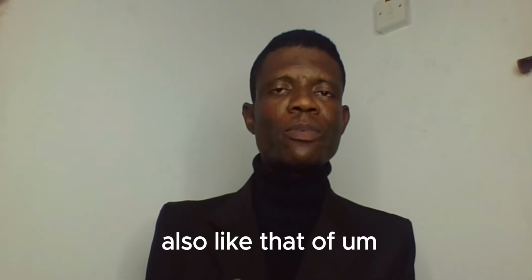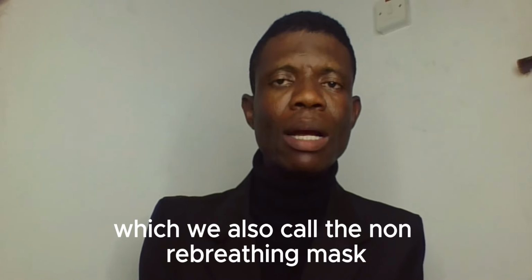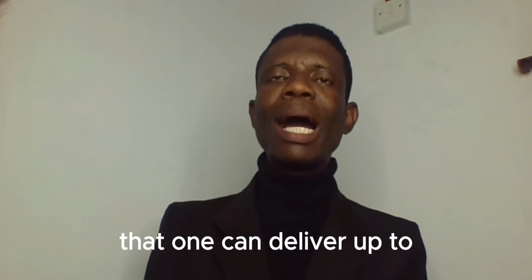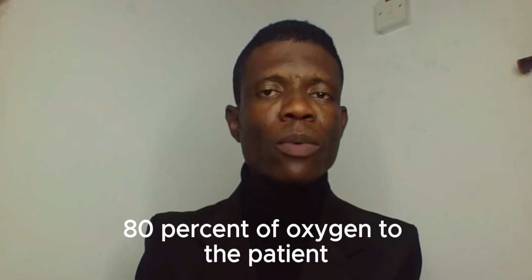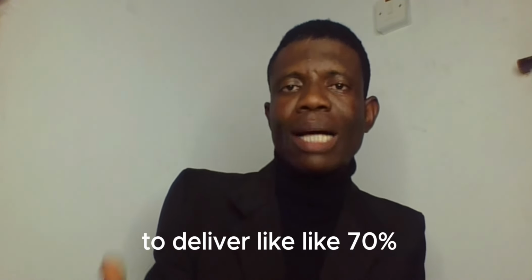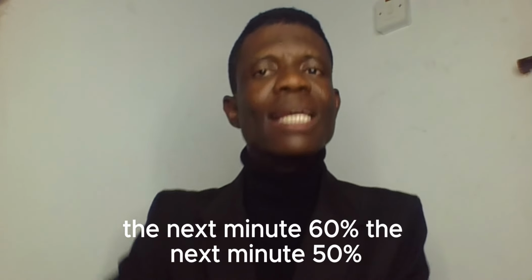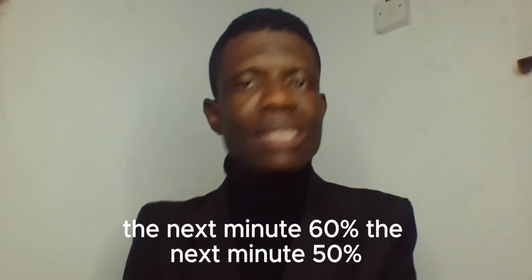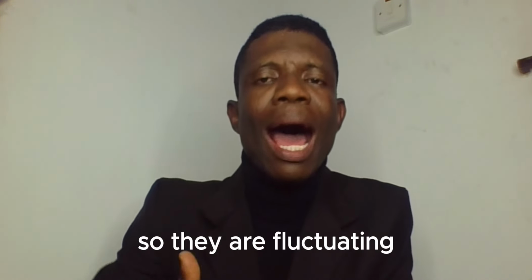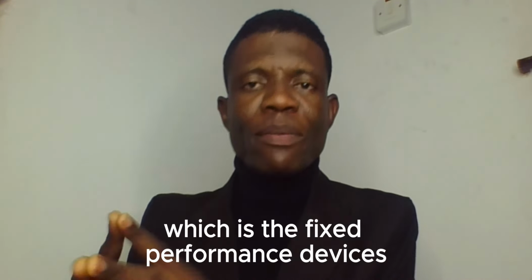Also, like the high concentration oxygen mask, which we also call the non-rebreather mask, that one can deliver up to 80% of oxygen to the patient. So in this minute, you can choose to deliver like 70%. The next minute 60%. The next minute 50%. So they are fluctuating. That brings us to the second one, which is the fixed performance devices.